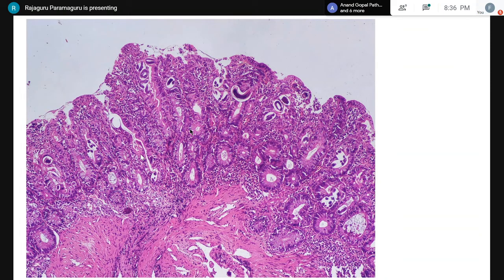If you can just wait for this, because this is very interesting. I can see a lot of things. If somebody could answer in the Google Meet, so many people can answer, and there are a lot of people on YouTube. Let's wait and see what they have to say. Komudi Patnaik said strongyloides. Very good, that's right, absolutely. But it might not be as heavy as this in most cases, so just keep that in mind also.